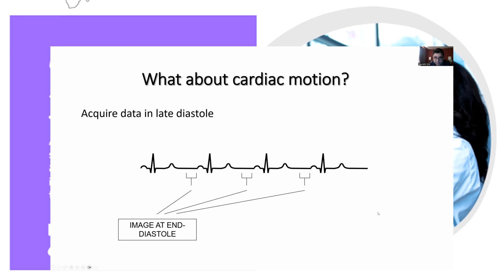It so happens, and this is where things can be very fortuitous, that the T1 time of blood is such that the inversion time of blood falls in diastole, when you coordinate the whole thing with the R wave of the ECG. So why is that important? Firstly, you need to coordinate cardiac imaging with some point of the ECG. That's the whole point of synchronization.